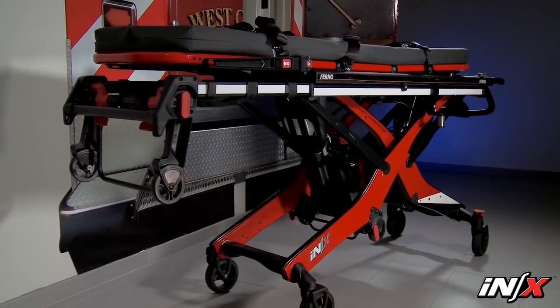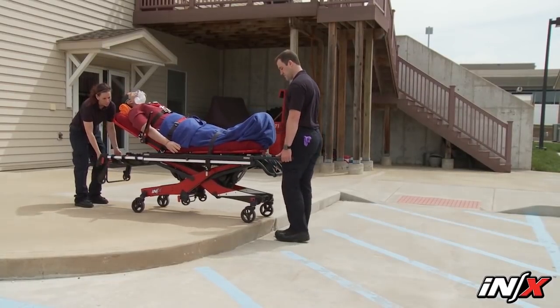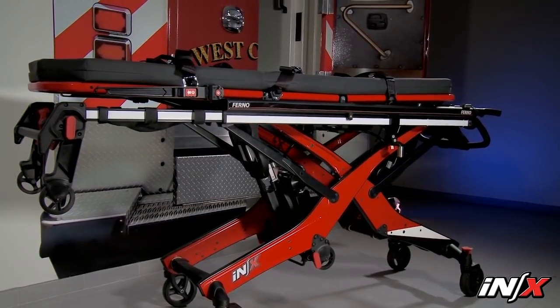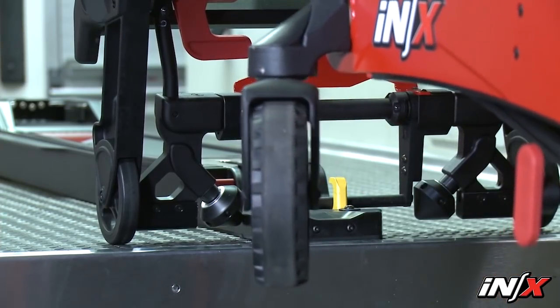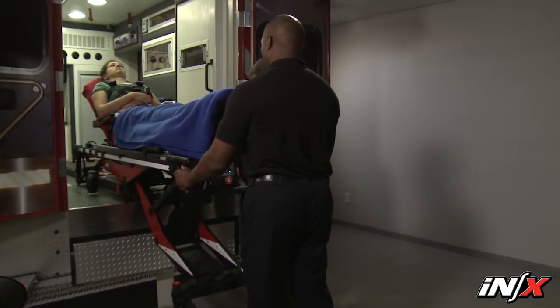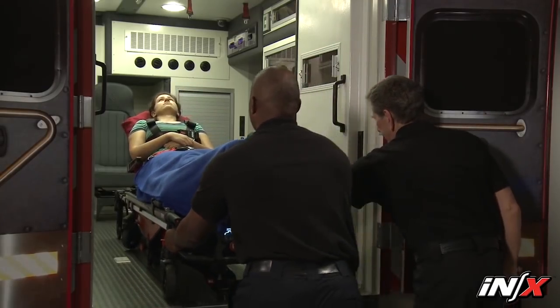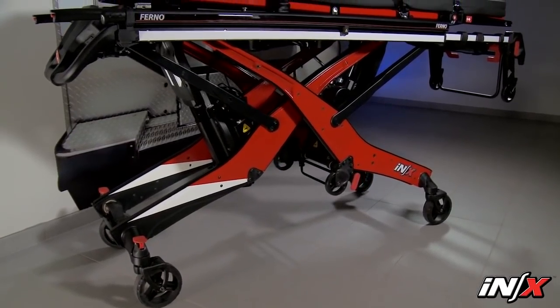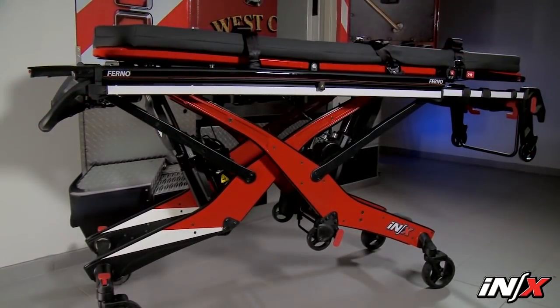The NX Integrated Patient Transport and Loading System is an emergency patient handling system designed to transport a patient over various terrain and to be loaded into and unloaded from an ambulance for ground-based transportation. The NX is designed to help reduce the risk of injury to medical service personnel by eliminating or minimizing the amount of lifting required during raising, lowering, or loading into or unloading from an ambulance, and should be used with compatible FERNO Fastening Systems. This video contains general instructions for the use, operation, and care of the FERNO NX Integrated Patient Transport and Loading System.